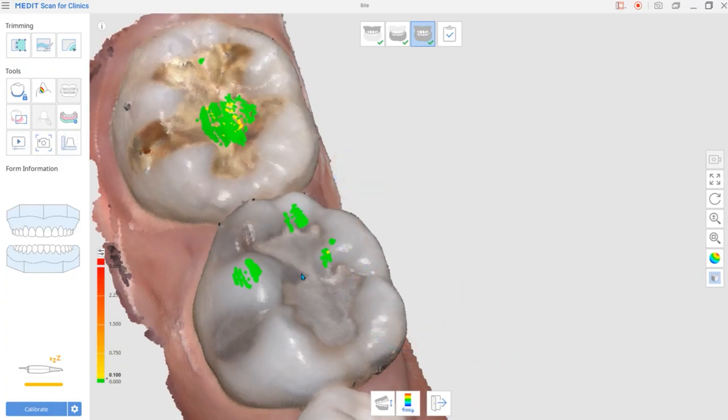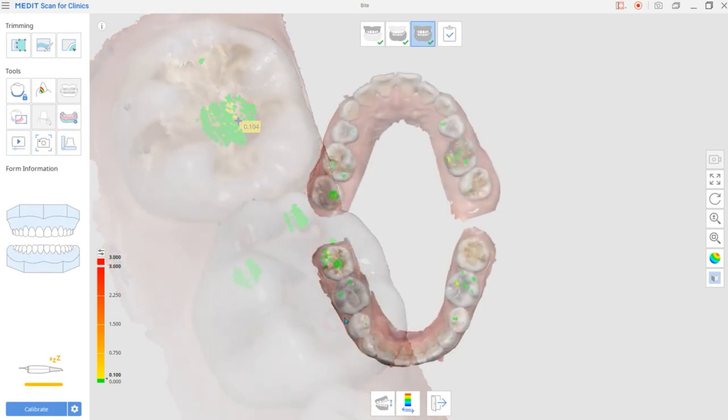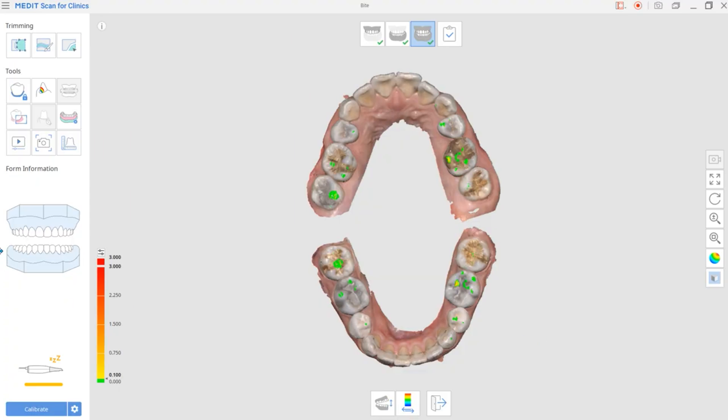If the cursor positions anywhere on the color, the system will show the deviation value for the selected area. If the resolution goes up, the color range spreads out.